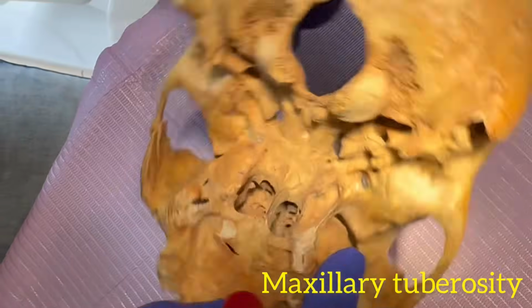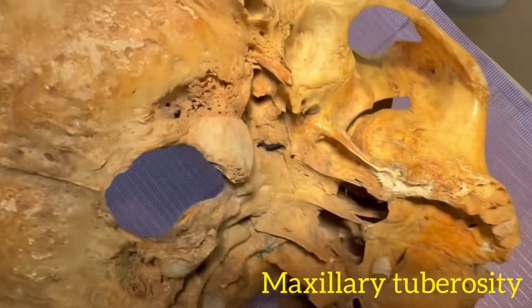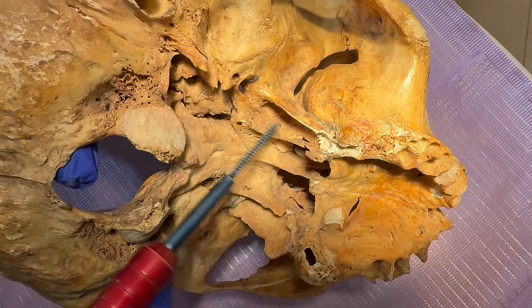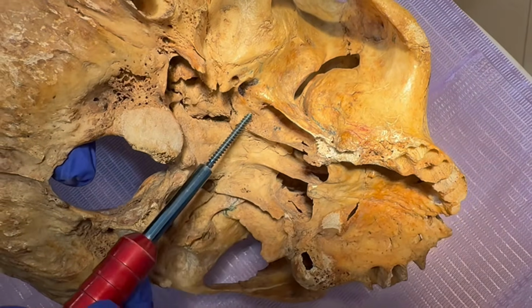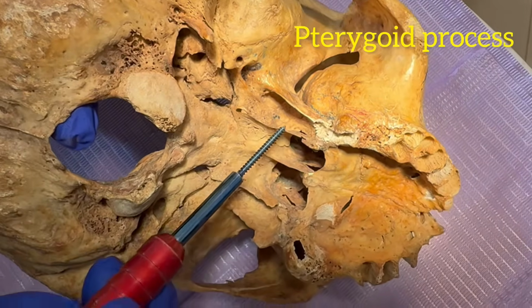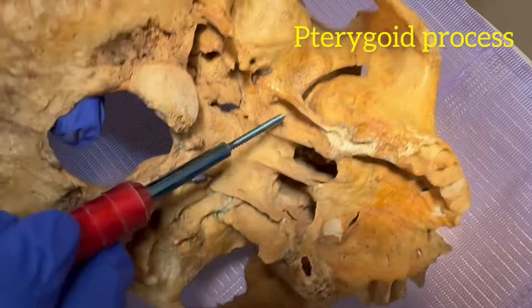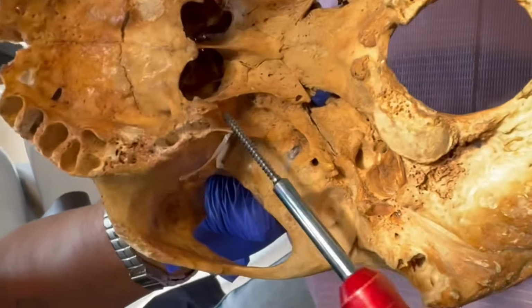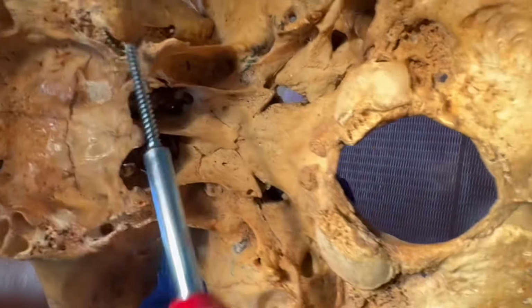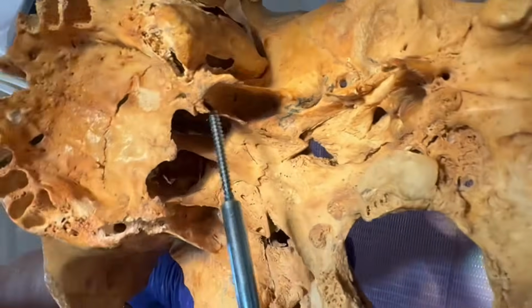Okay, so you can have a look. I'll show you the anatomical structures more. So continuing with the tuberosity, this is the pterygoid process, lateral pterygoid process, medial pterygoid process, and the pterygoid fossa. So this is the pterygoid fossa where you need to engage your pterygoid implant. Okay, in the same way you can see on the left side also. This is the pterygoid fossa.